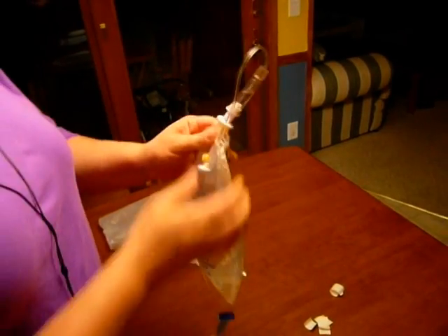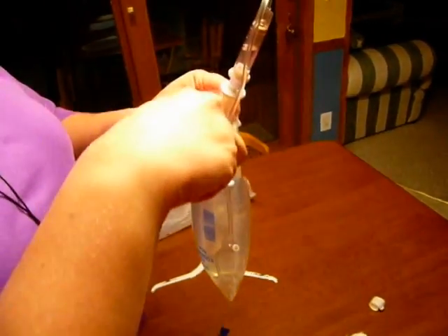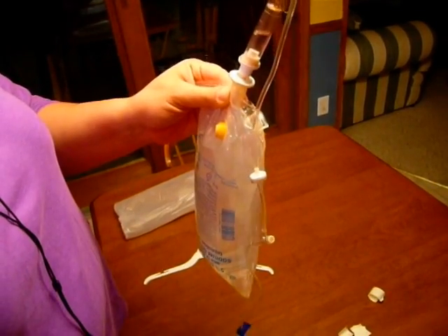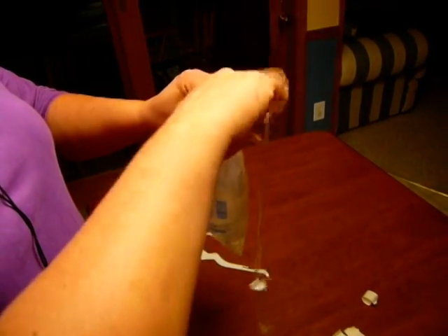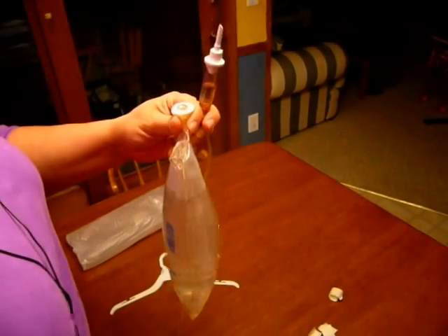So you're going to take the IV bag off the pump or the tray or the clip, and if you have a hemostat, which is one of these devices, you can come in and clamp it. If you don't, all you'll need to do is set it against something that can hold the bag. The next thing I'm going to do is take out the sterile spike, and put the cover back on that you took off before.